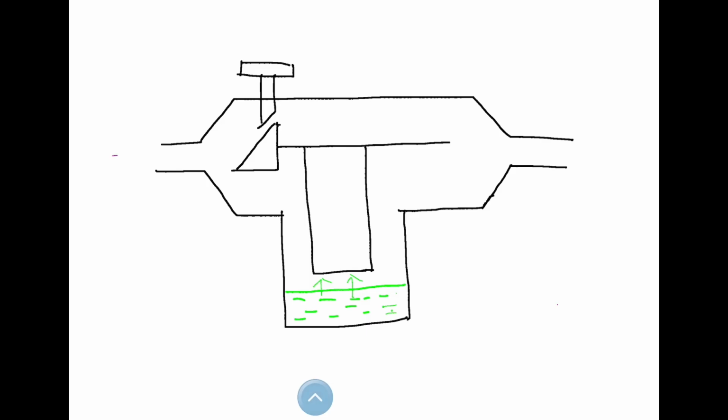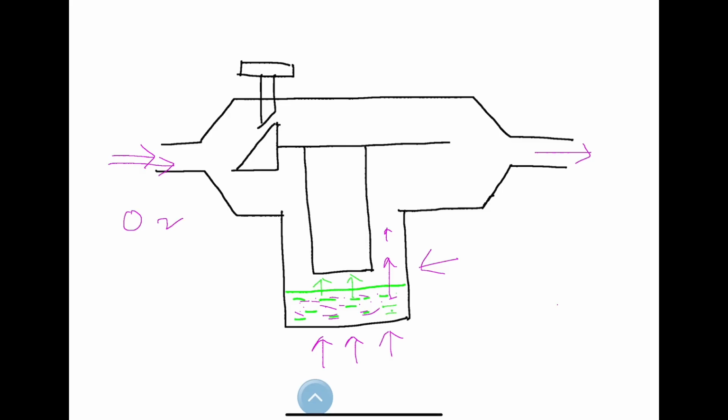Now this is a vaporizer. So we have an inlet, an outlet, and a vaporizing chamber. The liquid anesthetic is in the vaporizing chamber, and it is here that it gets converted into anesthetic vapors. Heat is generally applied to this liquid to maintain the concentration of liquid getting vaporized, as we have already discussed when we discussed the physics. Now fresh gas enters through the inlet. This fresh gas is generally a mixture of oxygen and nitrous oxide or oxygen and air.